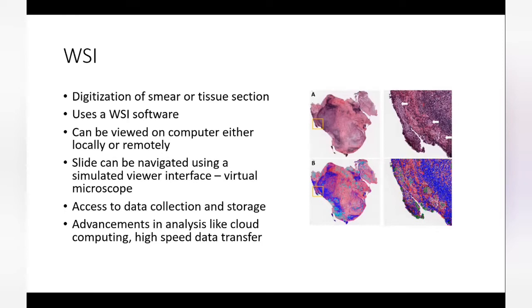What you see is basically a thumbnail impression of an entire section of tissue or of some biopsy. It could be a gastric biopsy or a prostatic biopsy, whatever. The entire stained section of that particular slide has been thoroughly scanned using a scanner, and it is now available on a computer screen with a software capability that will allow you to navigate the slide the way you would have done on your microscope.